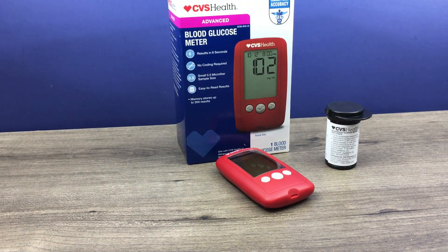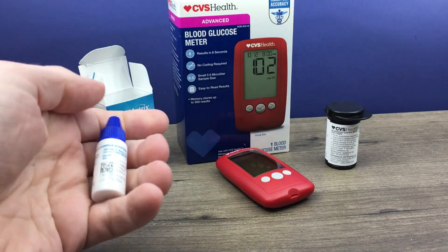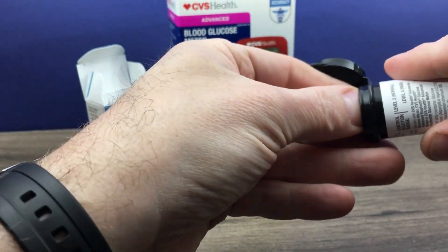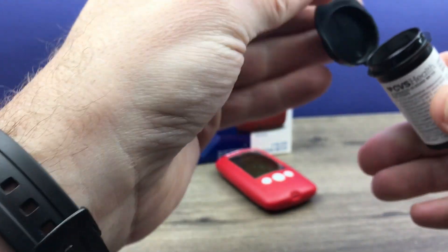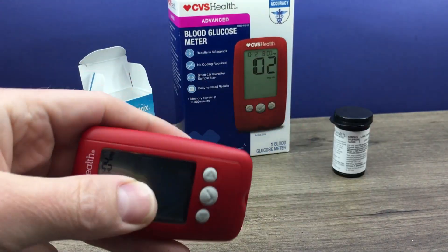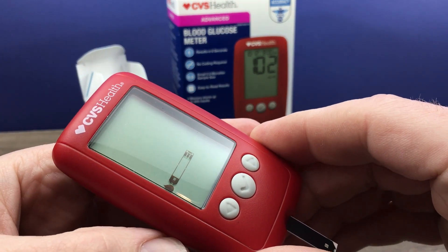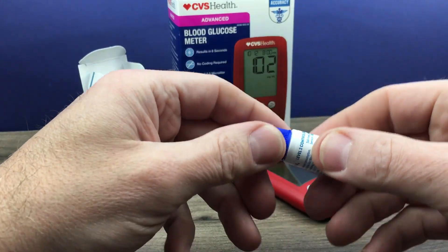So here is our bottle of control solution. First off we can insert a test strip. Always remember to keep the lid closed on that vial when you're not getting a test strip out. Insert that test strip just like you're performing a glucose test. Now that's prompting us for a drop of blood, so we can gently shake the control solution.